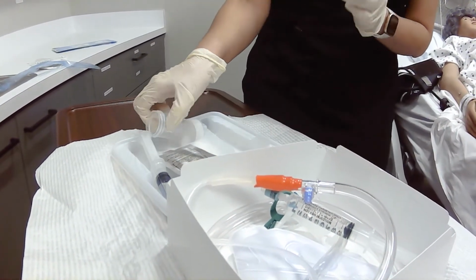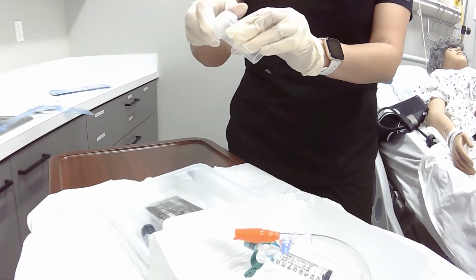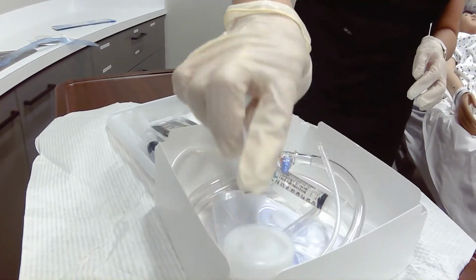And then since I do have to collect a urine specimen, I'm going to get this urine specimen cup ready. So I'm going to place it into the box so I can bring everything over into the box.